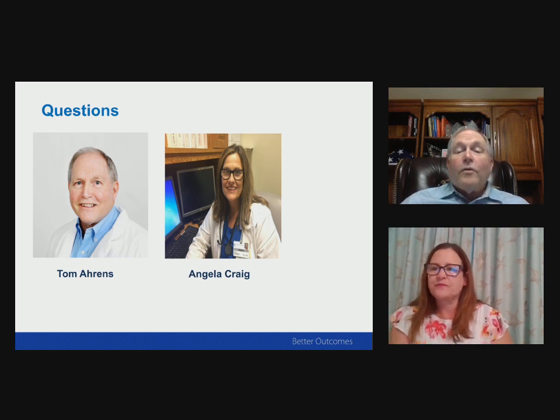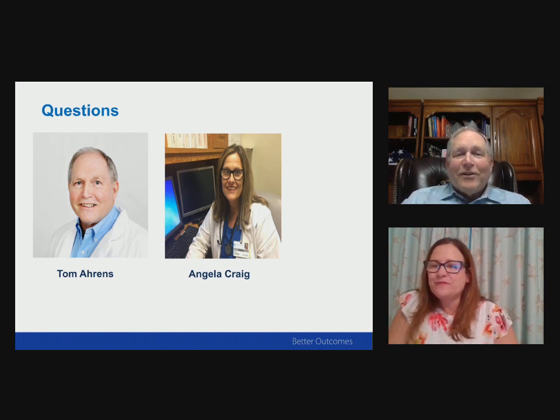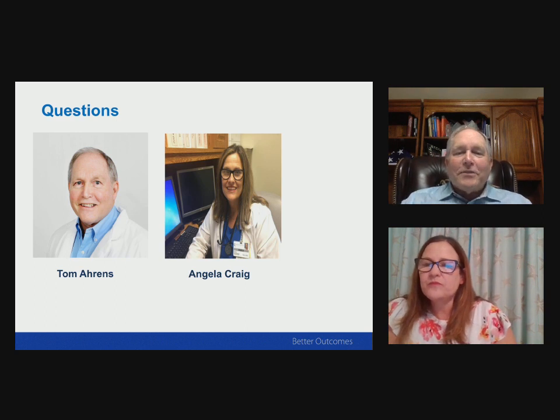Oh, yeah, please. If you want to defibrillate, you have to stop. I didn't mean to say that. I'm just saying if you're doing CPR, don't stop CPR to check for a pulse. Your capnogram will tell you that. So thank you for bringing that up. I don't want people going saying we shouldn't defibrillate.